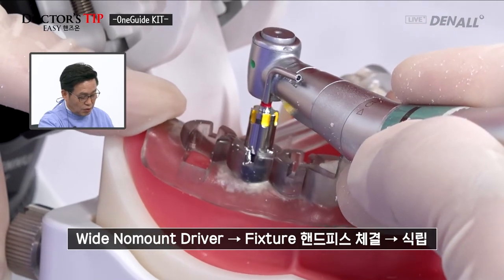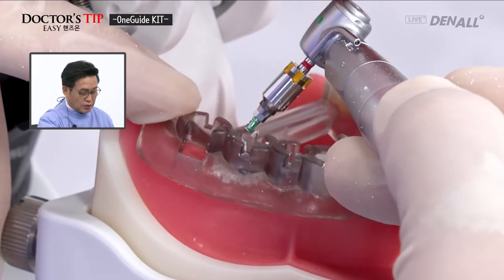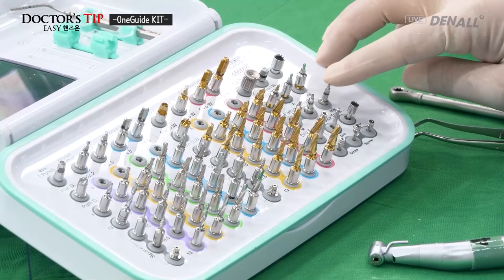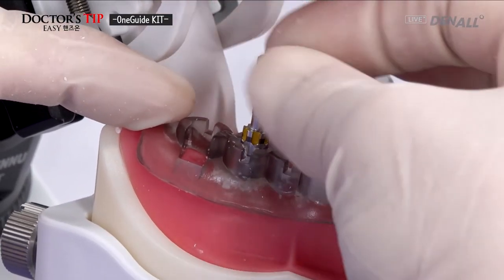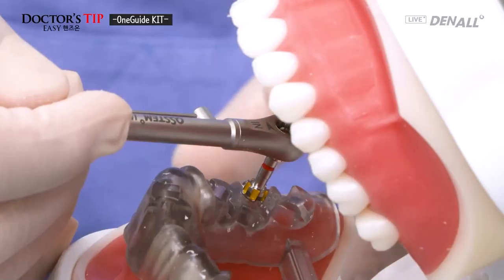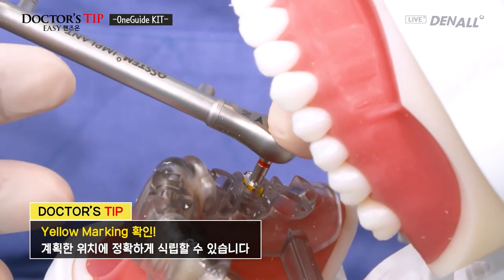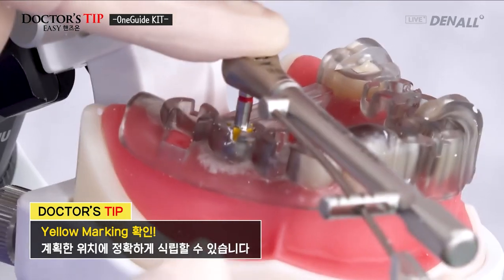Accordingly, the implant is going to be placed. So, engine driven, drill in up to 80% and remove as shown. In order to avoid jamming, you don't go in full, but you drill in 80% and you use the wide type fixture driver to fully position the fixture that is inside the bone. Using the hand wrench, you're going to do final fixture positioning. You do depth control and the yellow part. Once this is accurately aligned, you can get the intended position. The yellow part is aligned here, and the insertion torque is over 30 Newton centimeters.